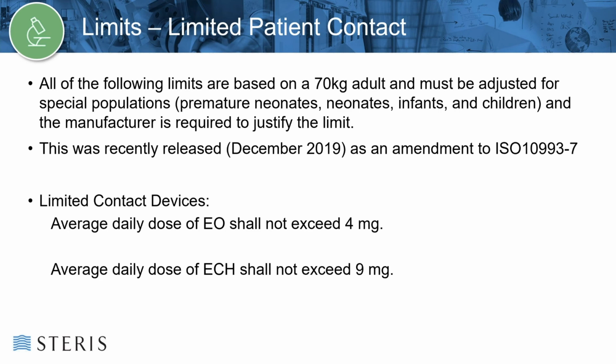The size of the device and the volume of the extraction fluid affect the detection of the test. The detection limit needs to be able to detect the acceptance limit for the device. The test container is filled entirely with water, as headspace or air can affect the stability of the sample.